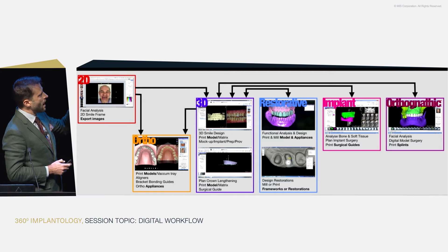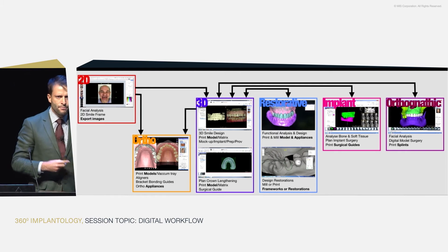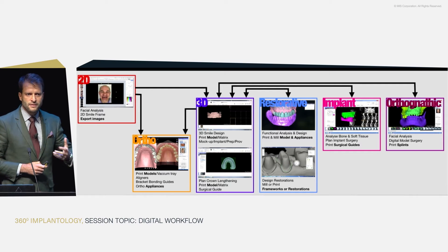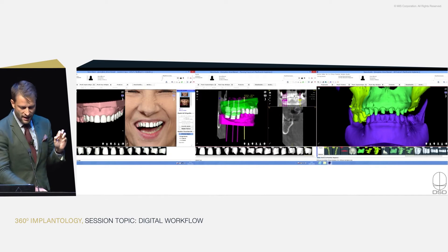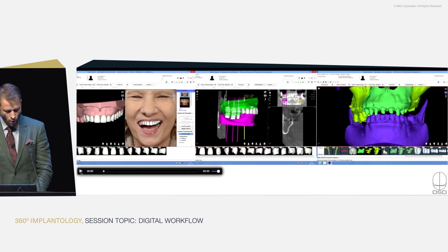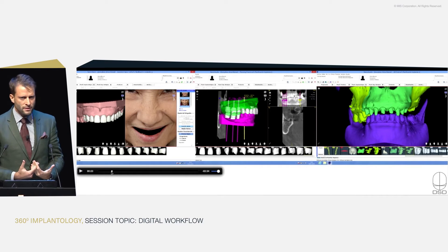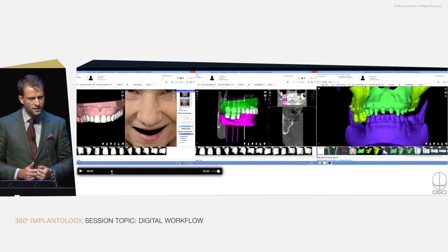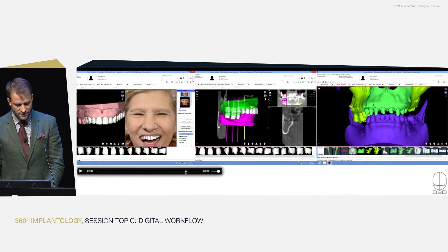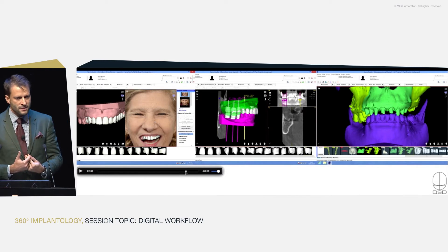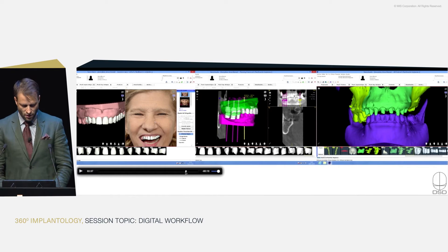We need somewhere that we can actually share patients and document in a simple way, create simple sketches, and have technicians trained on that to help dentists take advantage without having to do it themselves. A way that you can design the smile with the face and go through this journey of experimenting different ways of treating the same case and brainstorming about the best possibilities to offer the patient. So as we always do, the first step is always to plan the case from the face — and we actually have to erase the teeth so they don't fool us.